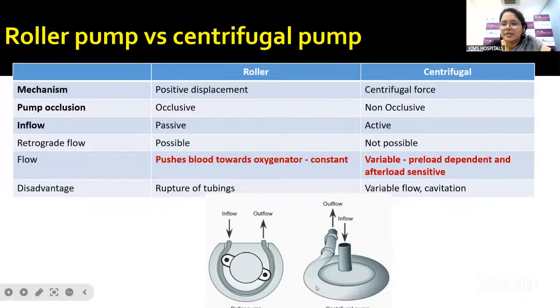On the other hand, the centrifugal pump that is more commonly used works on the principle of a controlled vortex. It generates a centrifugal force using a non-occlusive mechanism, wherein the flow is both preload and afterload sensitive.